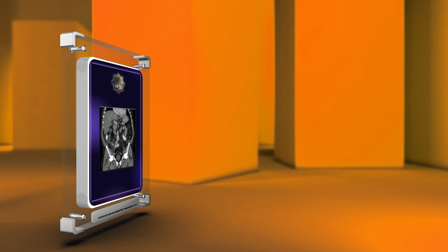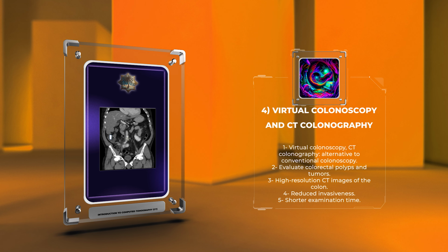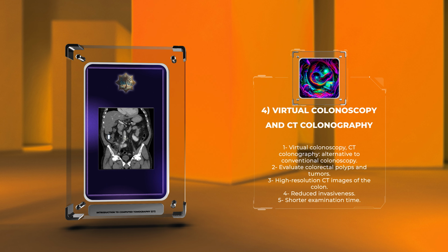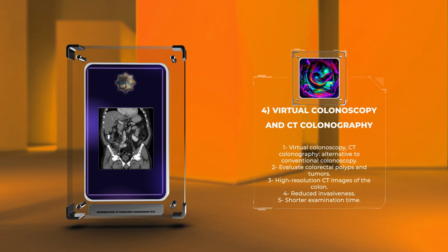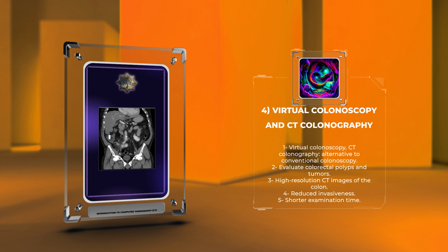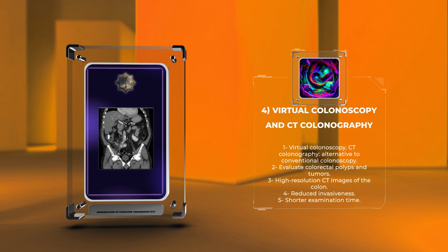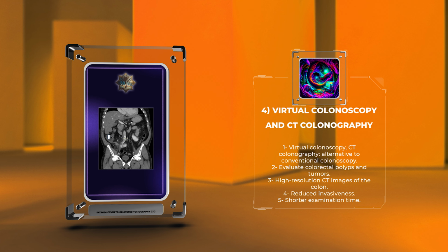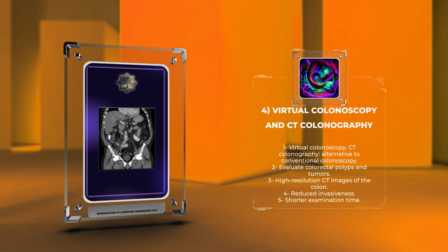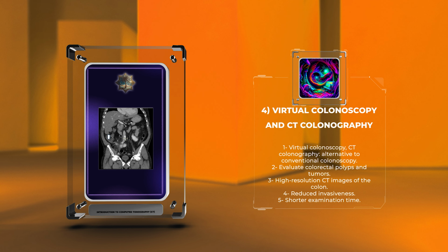Virtual colonoscopy, also known as CT colonography, is a minimally invasive alternative to conventional colonoscopy for the evaluation of colorectal polyps and tumors. This technique involves the acquisition of high-resolution CT images of the colon and subsequent analysis using dedicated software. CT colonography offers advantages such as reduced invasiveness, shorter examination time, and the ability to detect extracolonic findings. It plays a crucial role in colorectal cancer screening, monitoring, and surveillance.